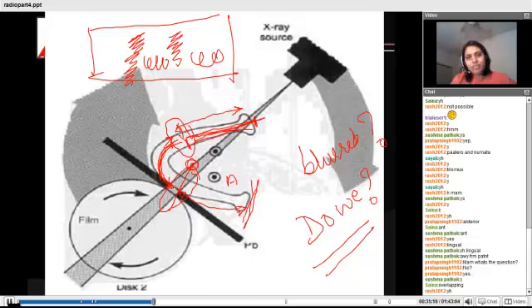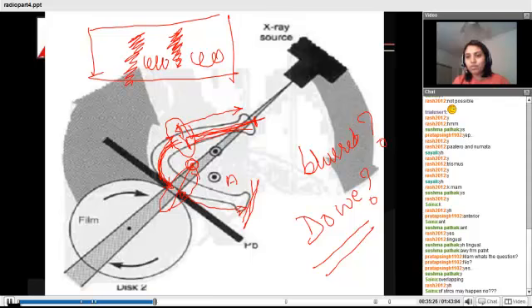Remember that this particular zone, you would have seen, there are 2-3 items. If you actually notice OPG images, you would see some kind of films wherein you see haziness totally in the center. There is some kind of film wherein there is haziness in the premolar zone. Isn't it? When we have that, know what exactly has happened.